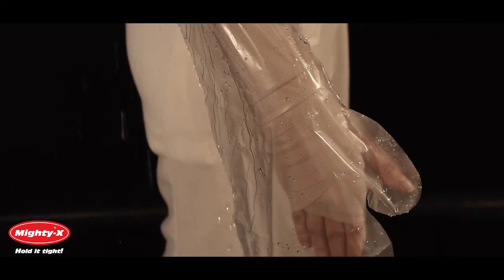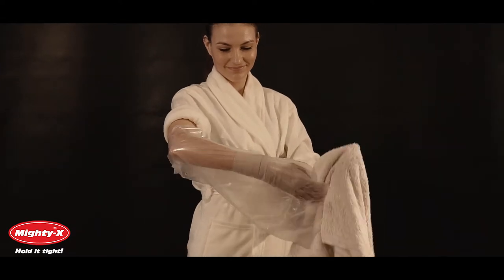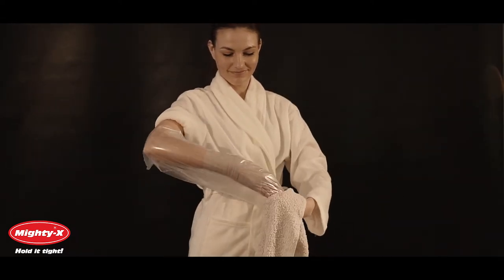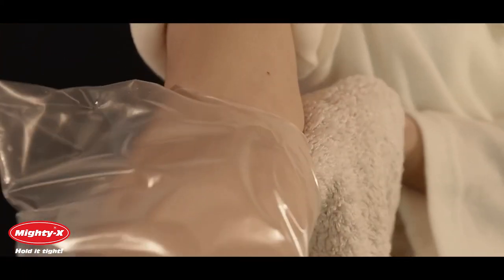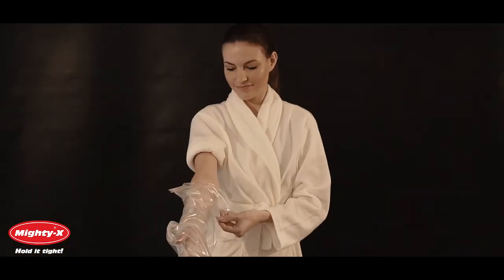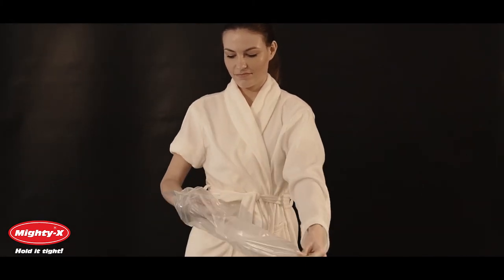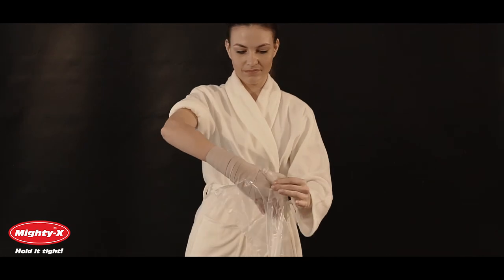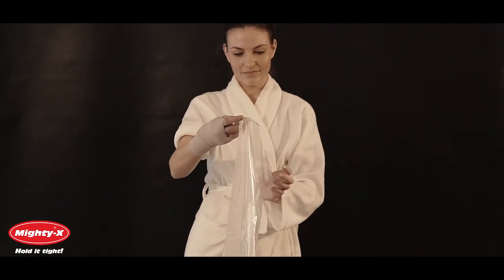In order to get multiple uses out of your arm cast cover, dry it completely with a bath towel and gently pull it off over the cast. Once removed, lay it flat in a warm, dry place. If you handle your arm cast cover with care, the opening will retain its elasticity. Each cover can withstand many showers, but discontinue use if it becomes too loose.